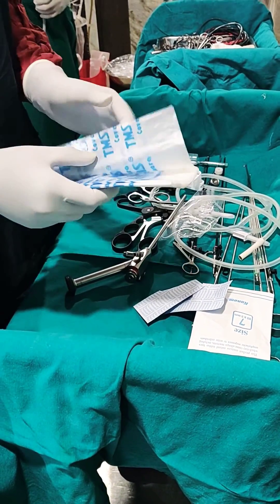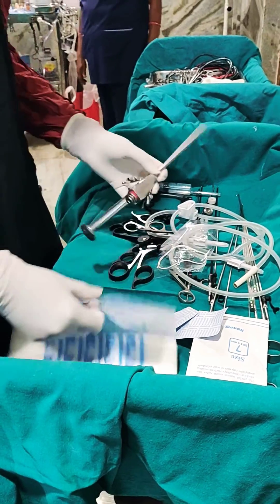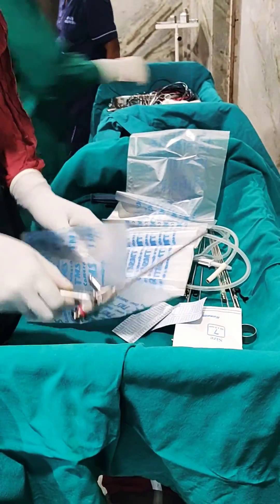I am going to demonstrate how I apply my camera cover to my endoscope. This is to make sure that my endoscope and camera does not get wet and sterility is maintained.